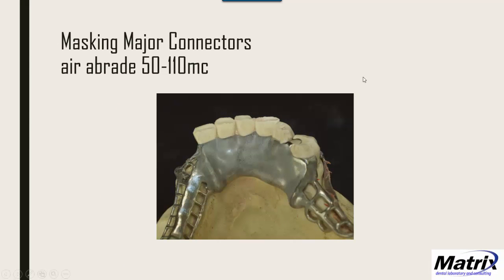The first step, just like with wrought wire, is to airabrade the surface with 50–110 micron aluminous oxide. If you need to protect any shiny areas like the rests, add a little rubber-sep on those areas and let it dry first. This way you can airabrade freely, then peel it off — it protects that surface from being dulled.